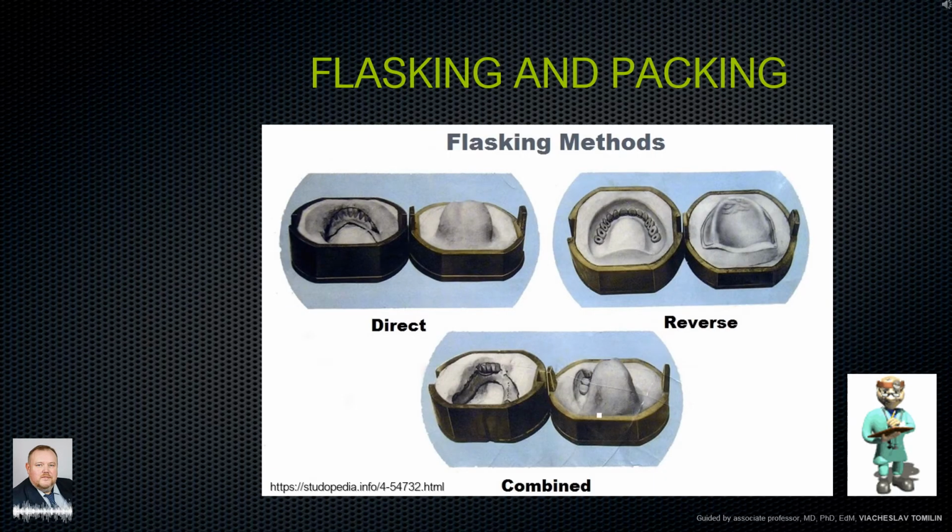Flasking and packing. Flasking methods. 1. Direct. 2. Indirect, or reverse. 3. Combined.